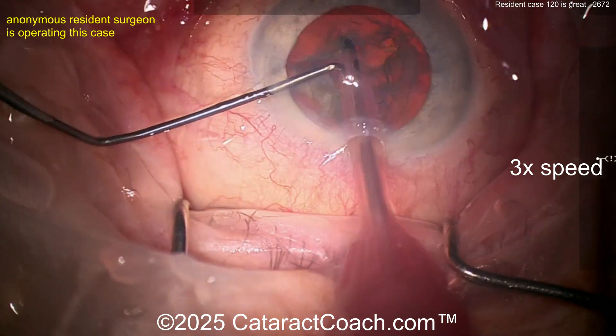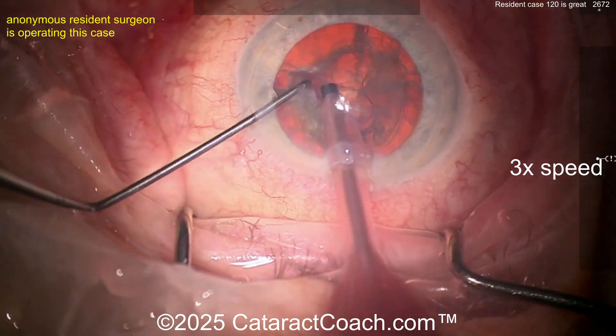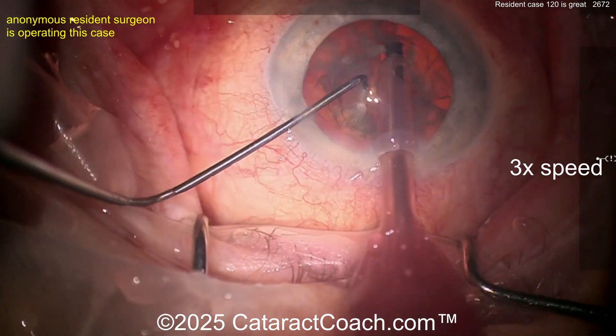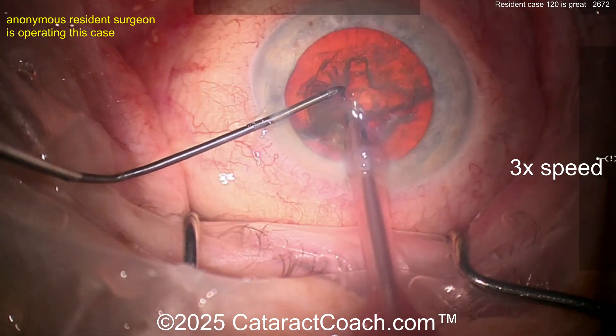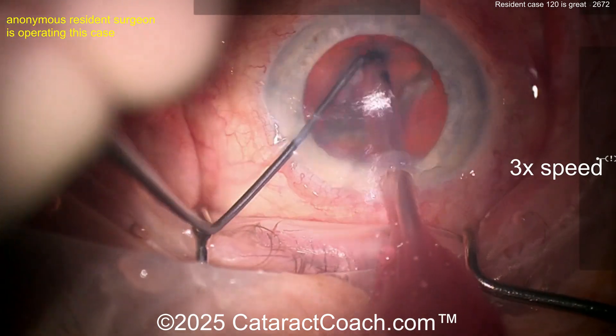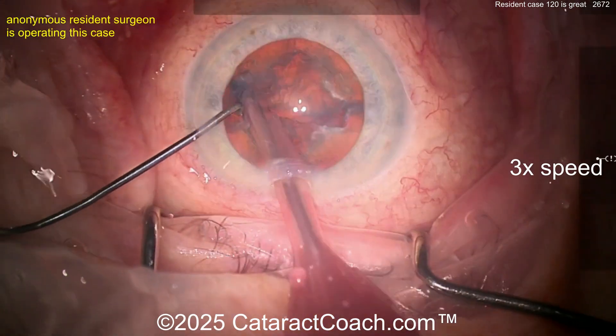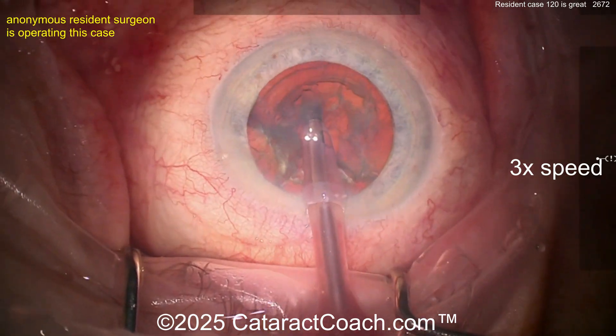Getting it rotated slowly — divide and conquer. A little bit of a groove there again. Center up the scope a little bit. That's been split now — you're going to take out a quarter, rotate it. That looks good, and then here's another little groove just a little bit more and you can split that up. It's a nice looking divide and conquer case.